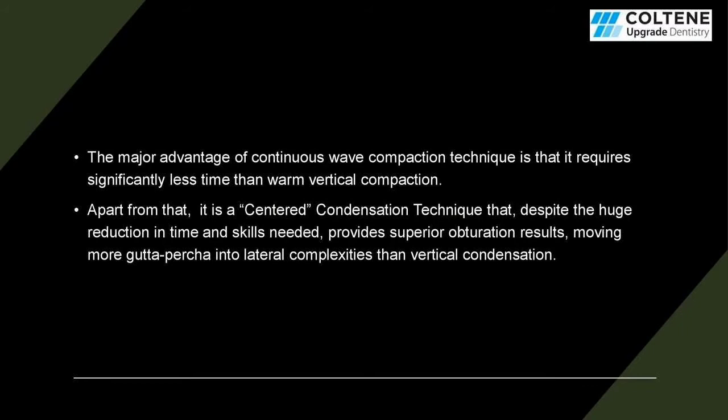So the continuous wave technique is basically a modification of the warm vertical compaction method. It is a procedural manipulation of that method, and it takes significantly less time than the original method. Another benefit of this method is that it is a centered condensation technique, and the skill and time required, as I've already mentioned, is much less than the original warm vertical technique, because when the condenser is centered in the canal, it automatically dissipates equal pressure around the canal system, which leads to an effective obturation.